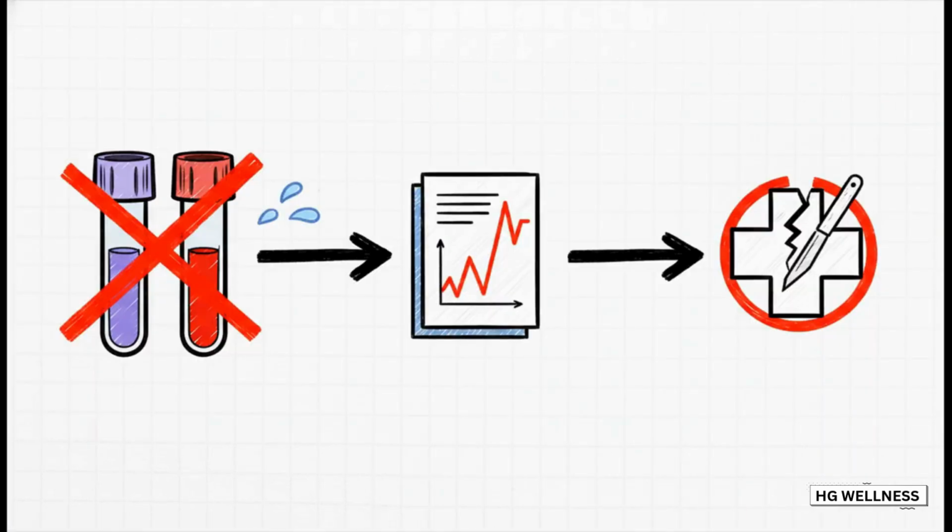So why is this so serious? Well, check out this scenario. If you draw a lavender top EDTA tube, which is full of potassium, before a serum tube, you can cross-contaminate that second sample. This can make it look like the patient has dangerously high potassium levels. Now, if that patient is being prepped for surgery, a doctor seeing that result might cancel the procedure or give the wrong treatment, which could have fatal results. The order of draw isn't just a guideline, it's a life-saving protocol.